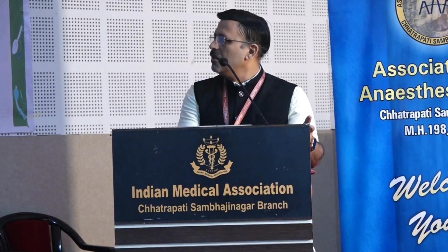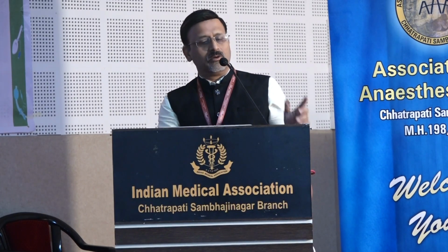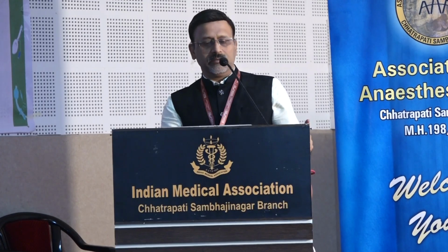It means you will maintain the saturation of the patient while doing all those things. What things are you doing? You are trying face mask ventilation, you are trying supraglottic airway, you are trying endotracheal intubation with the help of all maneuvers and whatever gadgets are available. But you will not go here. Once you go here, it will suck you inside and put you into trouble. That is why it is very, very important to maintain alveolar ventilation and airway patency.